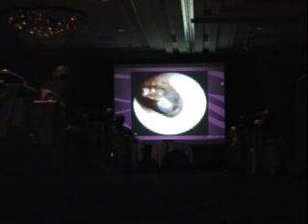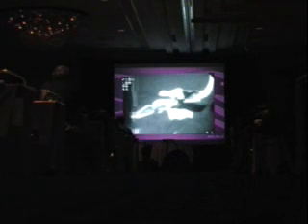Last topic, bulging red tympanic membrane. Differential diagnosis is a glomus tympanicum, which can sit right on the tympanic membrane and make it bulging red. The tympanic membrane runs from the scutum to the tympanic annulus. A little glomus tympanicum could sit right on there and cause a bulging red tympanic membrane.